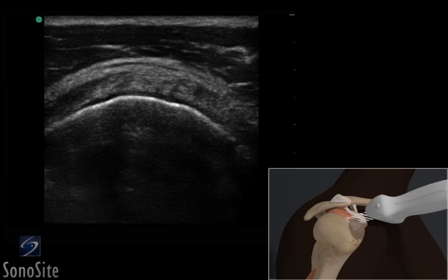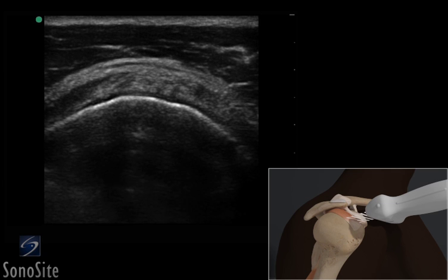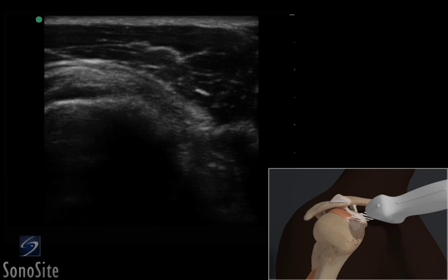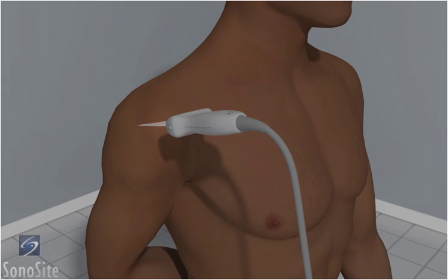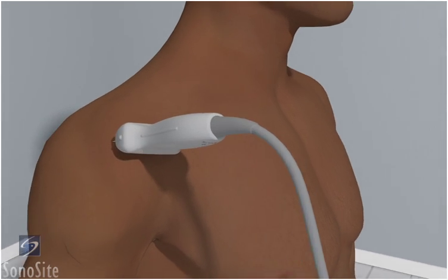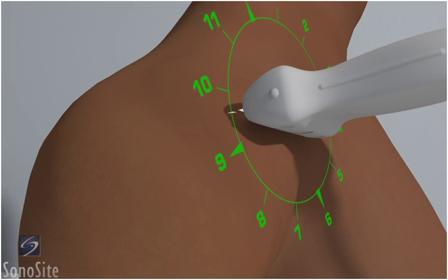A linear array transducer with a musculoskeletal exam type is used to perform an ultrasound examination of the supraspinatus tendon. The patient is in a sitting position with their hand placed back reaching toward the opposite shoulder blade. The examiner is positioned in front of the patient with the transducer placed over the lateral shoulder area with the orientation marker angled at a 10 o'clock position.